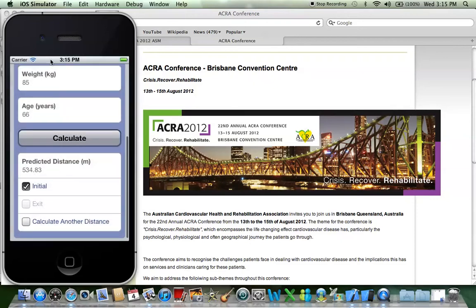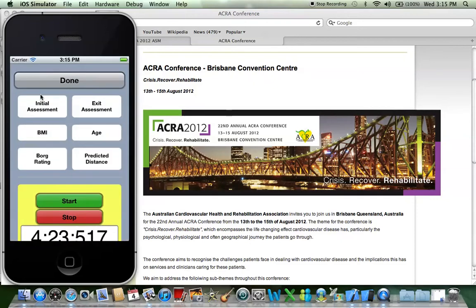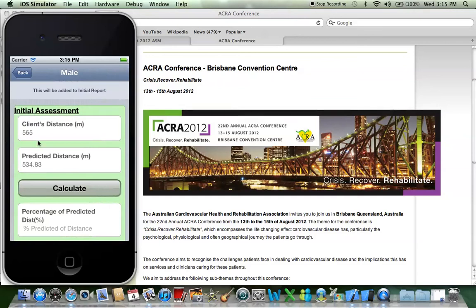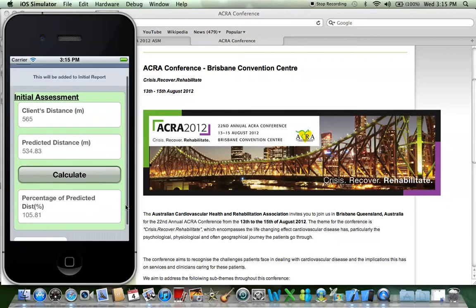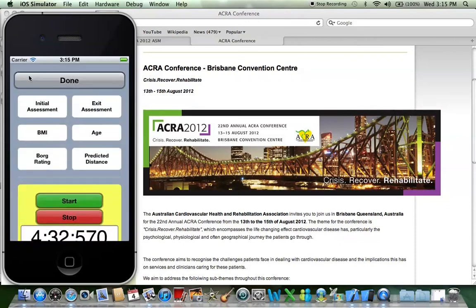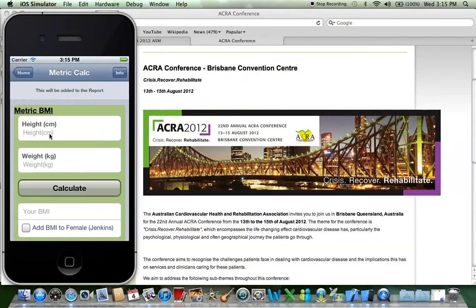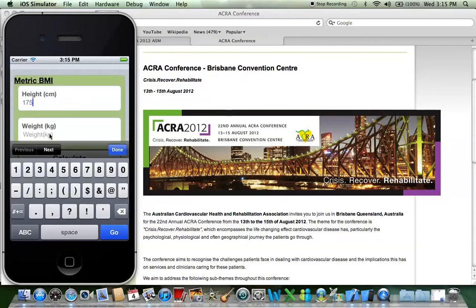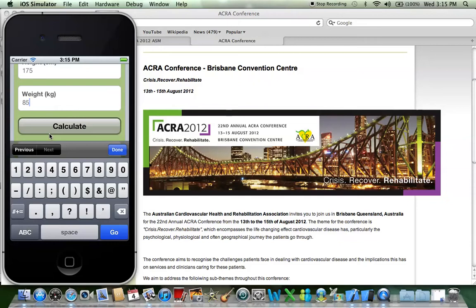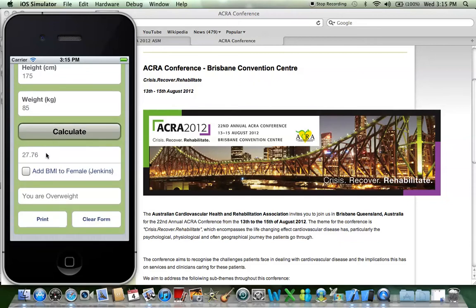I can add that to the initial assessment. Let's go back and go to the initial assessment — we can actually calculate the percentage of what they've done. They've done really well there at 105%, that's good. We've got the initial assessment filled in. We haven't got the BMI filled in, so we can actually do that — it goes on the report as well. With the Jenkins formula, it uses the BMI for females, so you can add that and it will add that on to the female formula.